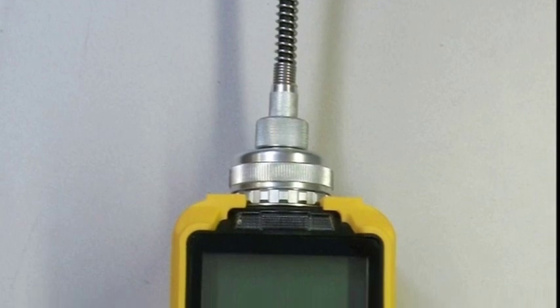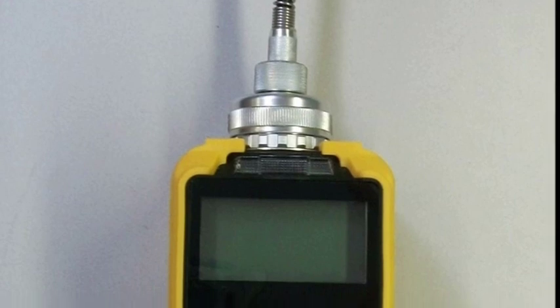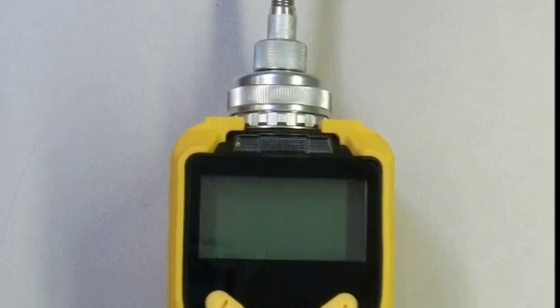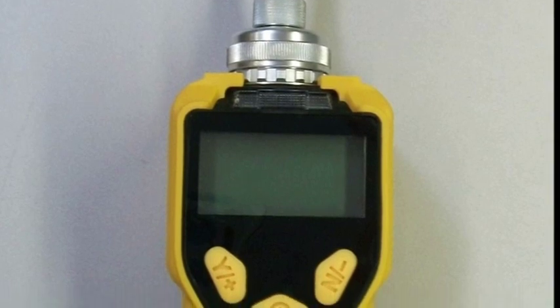The MiniRay 3000 detects VOCs at a range of 0 to 15,000 parts per million. It features real-time readings, wireless data logging capability, and humidity compensation.